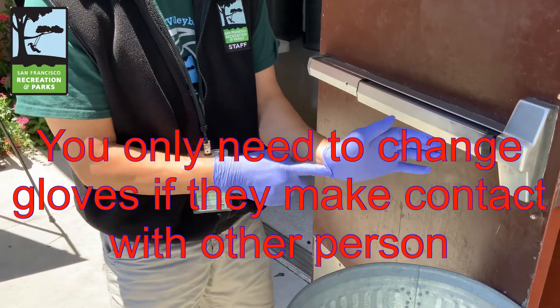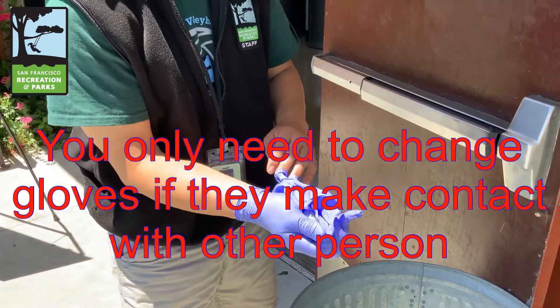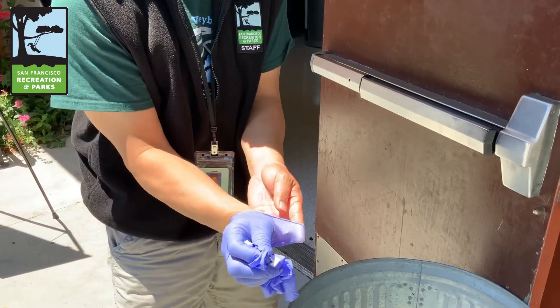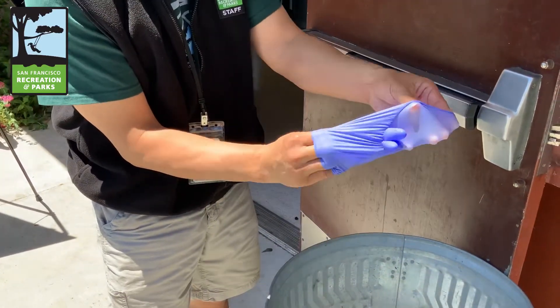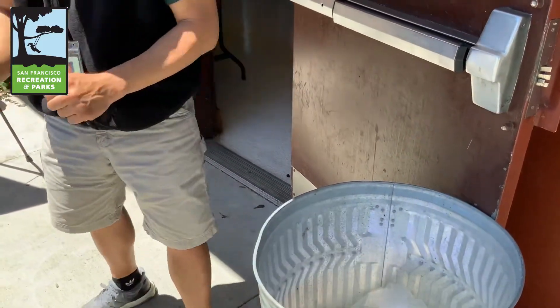After cleaning your temperature taker, dispose of your gloves by grabbing the cuff of one glove, encompassing the dirty glove and your other glove. Reach under the glove and dispose of your dirty gloves.